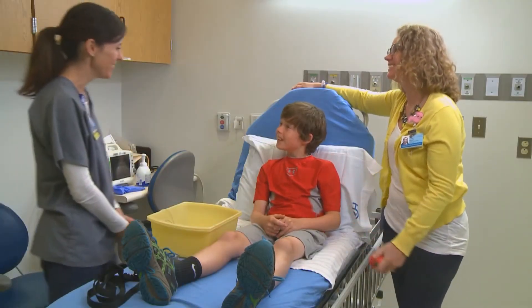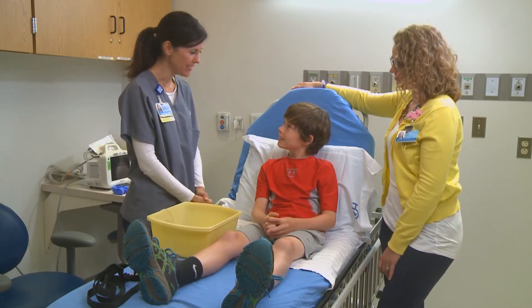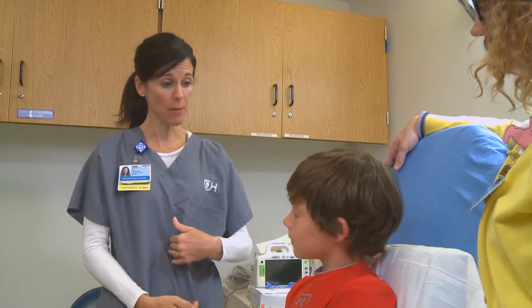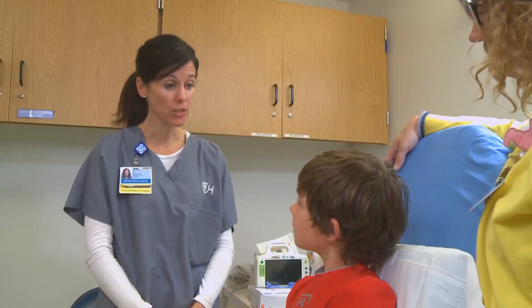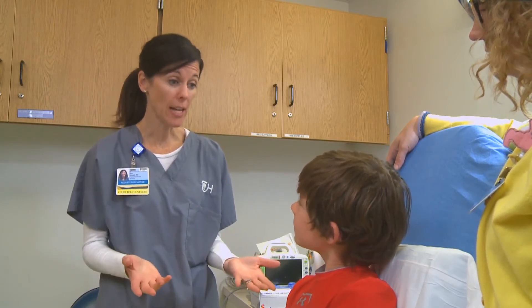Hi Brady, how are you? My name is Carrie, I'm one of the nurses in the endoscopy suite. I'm here today because sometimes after you eat, you have pain in your belly. So your doctor ordered something called an impedance pH study, and this study is going to help us find out what's going on after you eat.